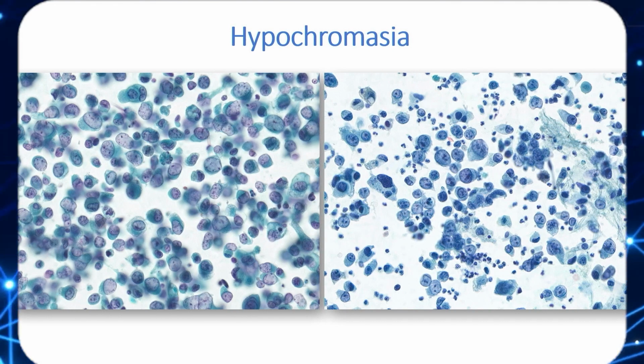Hypochromasia. This is really something I was not noting in my practice at all. I mean, we use ThinPrep, so that is alcohol-fixed tissue samples that have been processed as a cytology sample. You can take a look at it here, these are coming from a cytospin sample, so this is a little different. Hypochromasia is noted there, but at the same time, NC ratio for most cells is very high, and the nuclear membrane is giving you quite a bit of irregularity. So this is easy to recognize as cancer, but with our criteria, that can be a challenge.